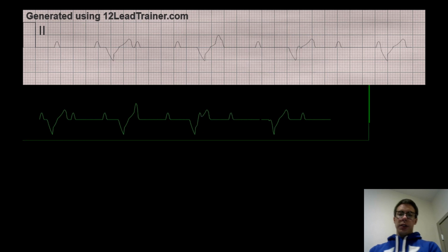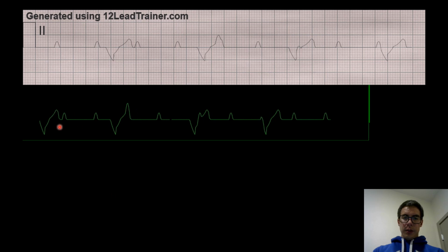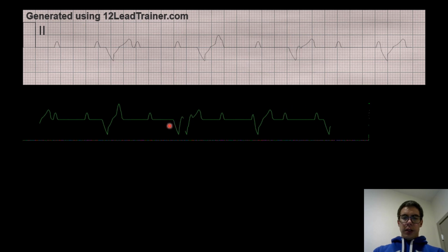And then here's the dynamic cardiology to that. So P wave, P wave, there's a P wave there, there, there, there. There's one in here, one in there, boom, boom. I'm just circling the P waves. So yeah, that just takes practice.